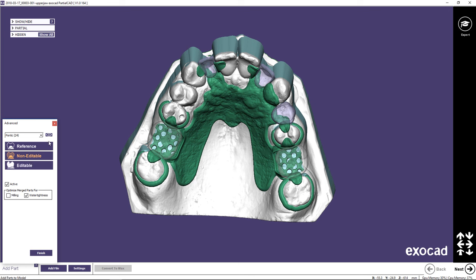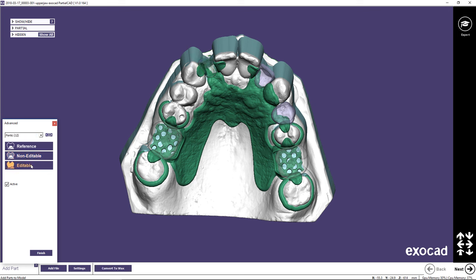For this tutorial, beads will be added to the metal backings. Therefore, the Editable option will be chosen. Choose the tooth to import, select Editable, then Convert to Wax. Repeat this process for all the teeth you wish to convert to wax.